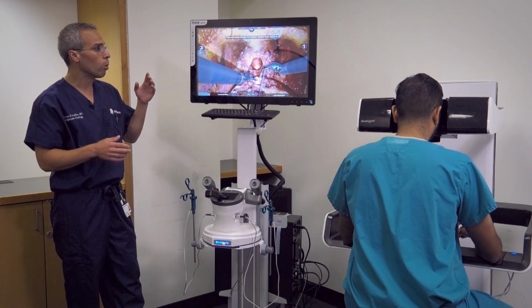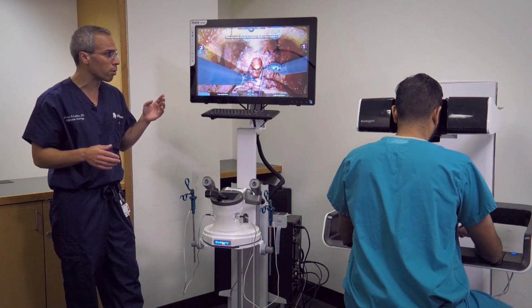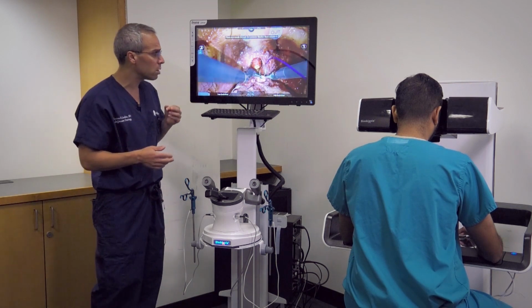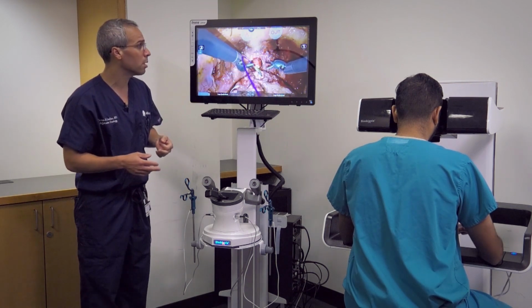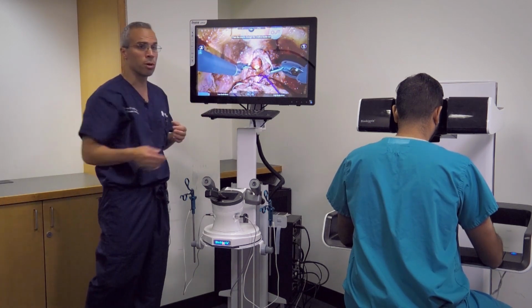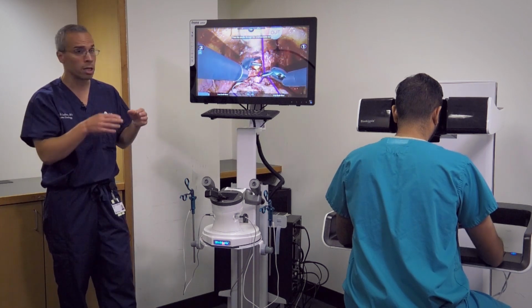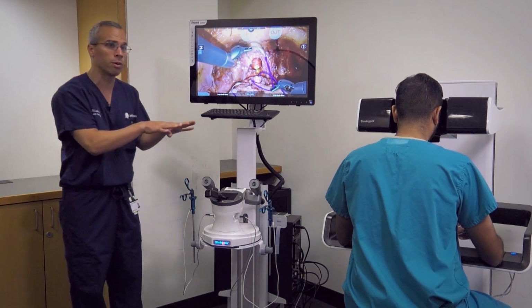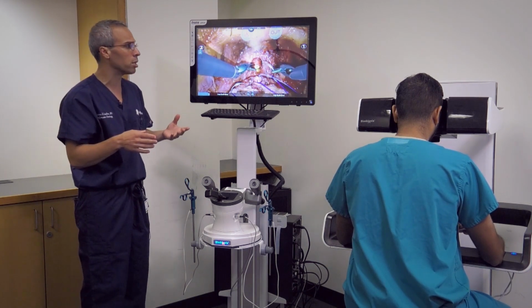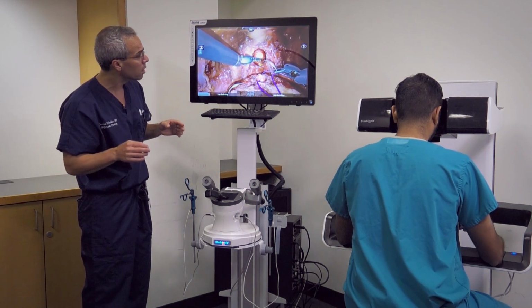And again, one thing that I was sold on when I saw this software the first time was the realism, how the tissue behaves, the anatomy, even the suture. So this suture that they're showing you is a barbed suture. This is what we use in the operating room. And it's a suture that has small barbs on it. All the barbs go in the same direction. And what that does is it gives you constant back tension. And I think it makes the anastomosis a little bit more tight.